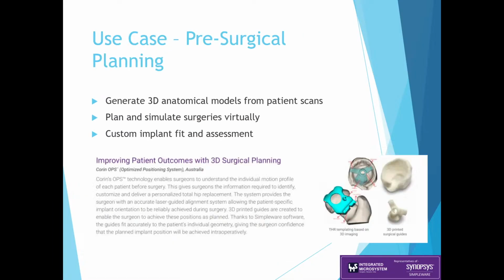Apart from this, in any sort of pre-surgical planning, for example, checking the surgical cutting guides that are being created or any surgical guide that we are using, that can be cross-verified in a virtual environment.